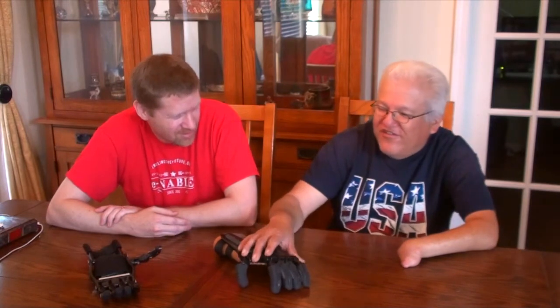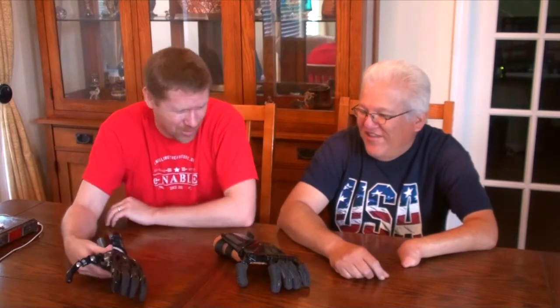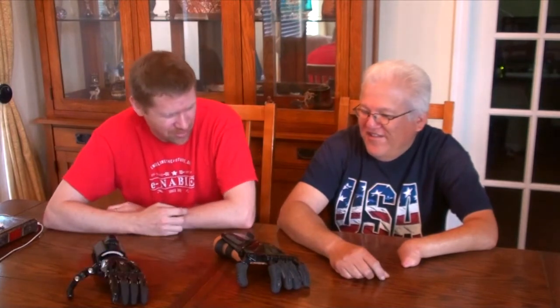So we can tighten up that little finger and give you a better grip there. Jose, you work as a box handler, right? Yeah. So you're using this to literally lift things all day long and it's held up well, I take it. Oh yeah. This is a lot heavier duty than that one. And this one held up for three years. Yeah, so that bodes well for the Osprey design — hopefully that'll last a long time for you.